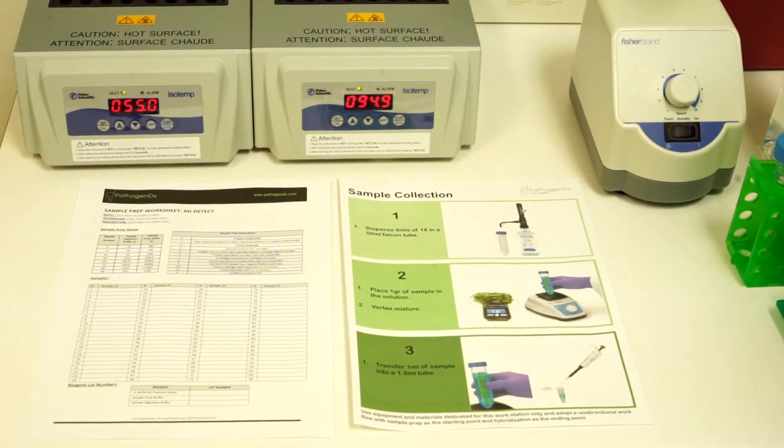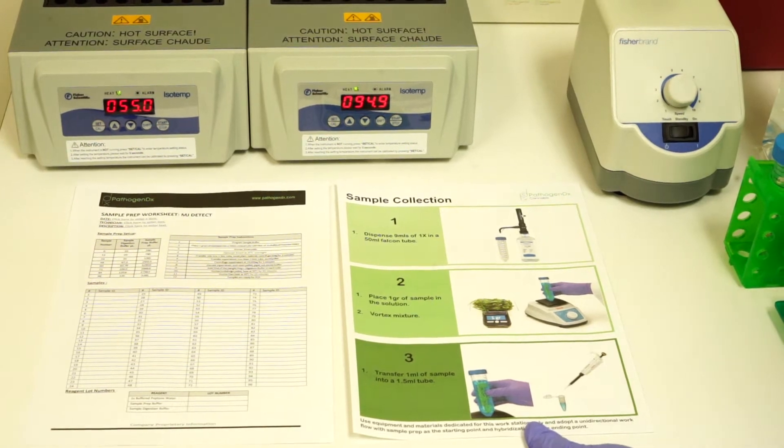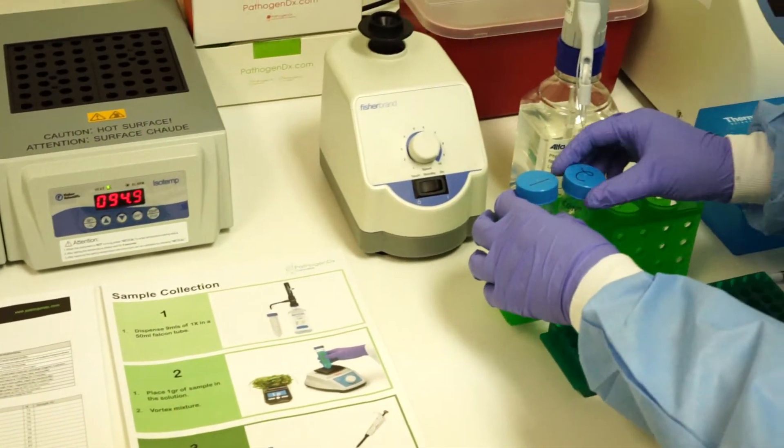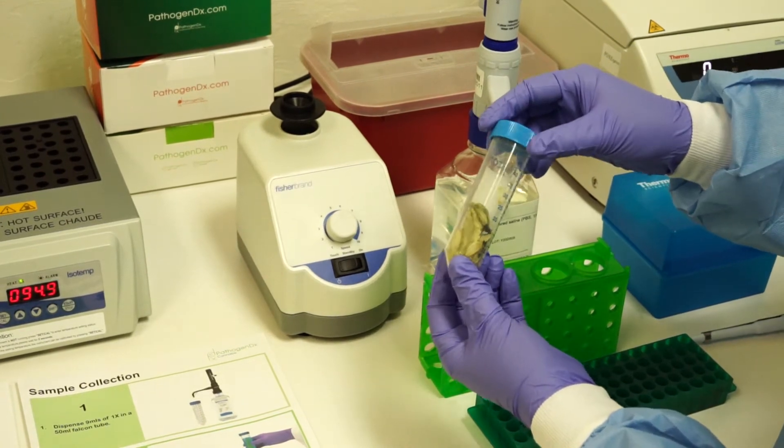To begin sample prep, please refer to the sample prep worksheet and the Quick Guide for instructions. To begin, weigh one gram of your cannabis sample into a 50 ml conical tube.